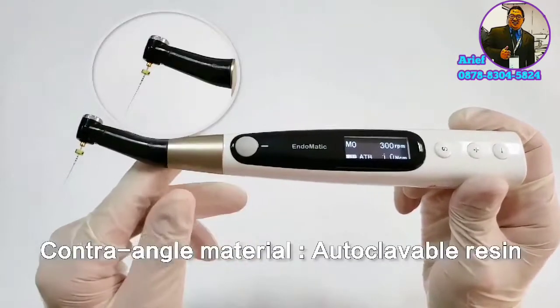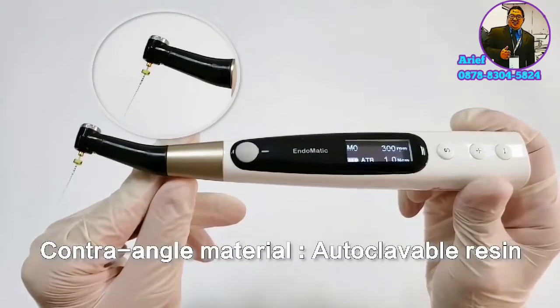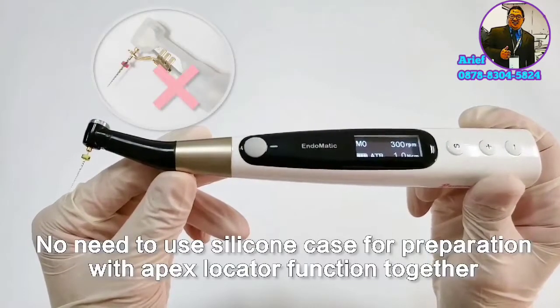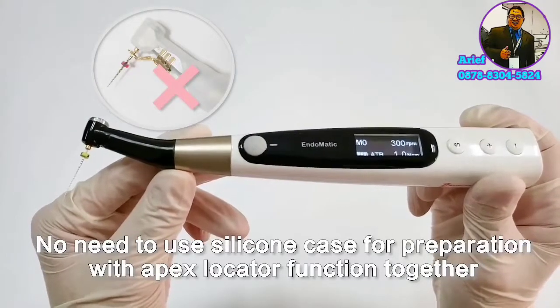Let's look at its contra-angle. It's made of autoclavable resin. So for preparation with the Apex Locator function, there's no need to put on a silicon case.